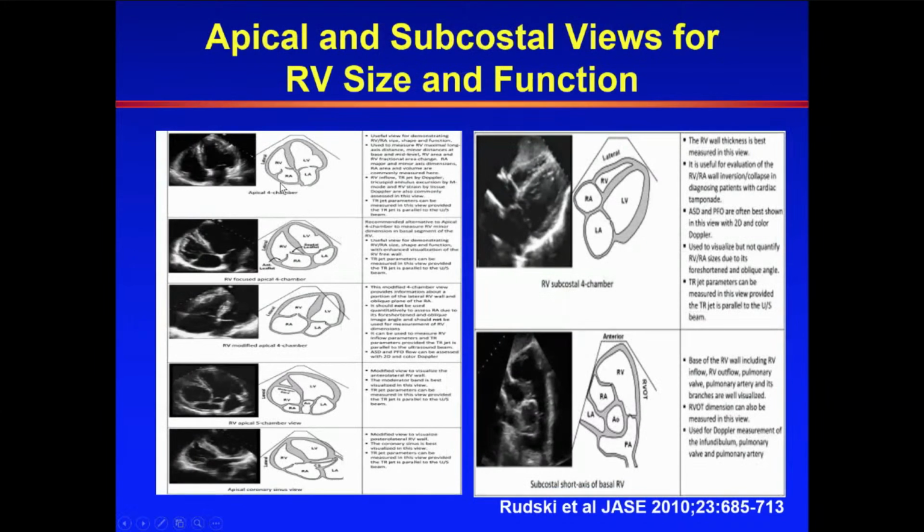You are all familiar with the standard apical four-chamber view, and this is a view that is used to measure right ventricular dimensions, minor and long axis dimensions.